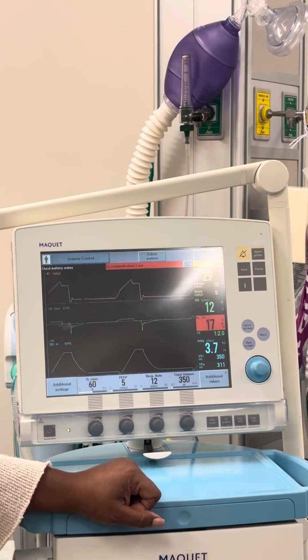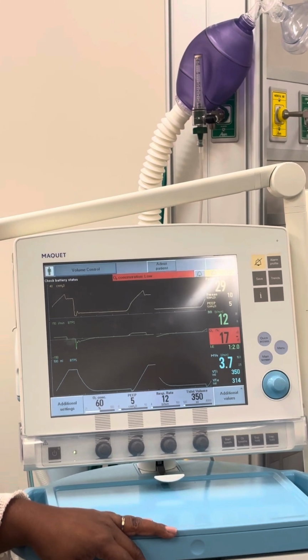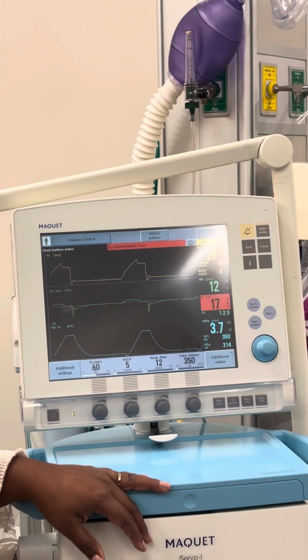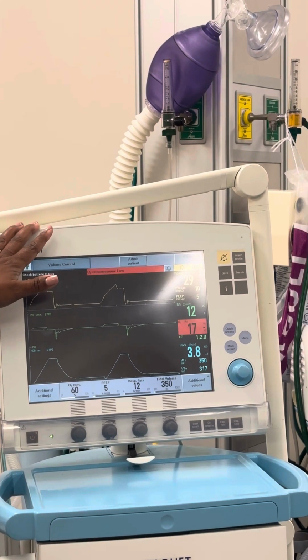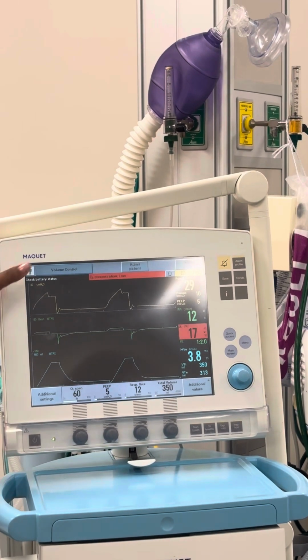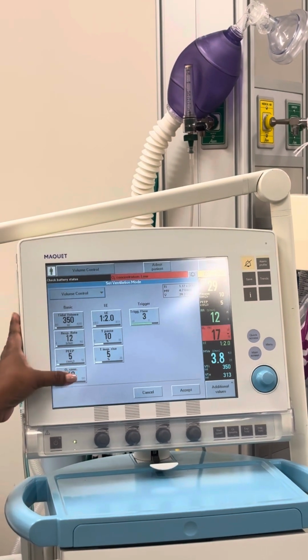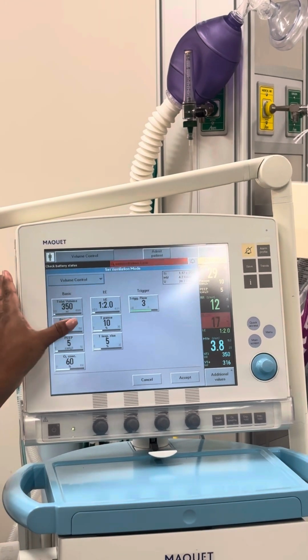So we set our alarms, and now we're going to do our monitoring, right? I'm going to start with the patient, do all my monitoring with my patient, do all my monitoring with my ECG, and then I'm going to come here and do my monitoring on the ventilator. I see where my settings are. My settings actually show up here. I can adjust my settings back up here, right? If I hit that top button here, I can go through and adjust my settings if I want to.